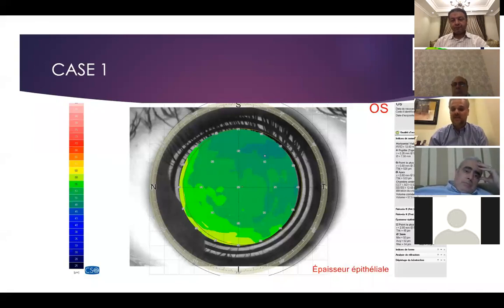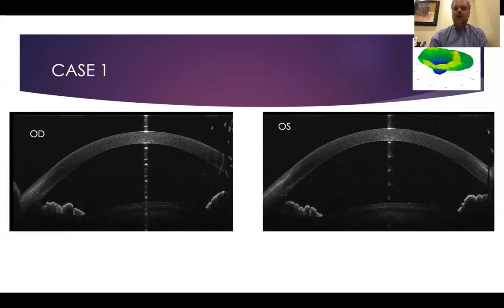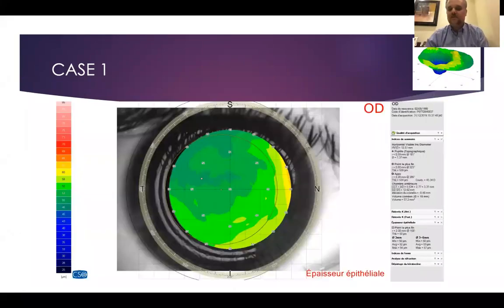So in this case, there is no keratoconus, and we are looking here for scars, and I will do a discussion in the end. In this case, following the studies of Dan Reinstein, there are a lot of studies on this. You can exclude the keratoconus in this case.